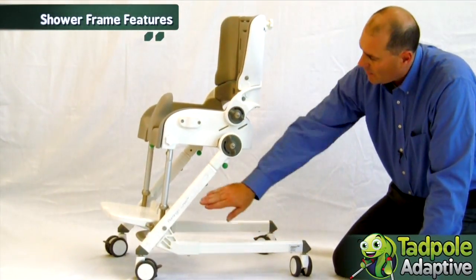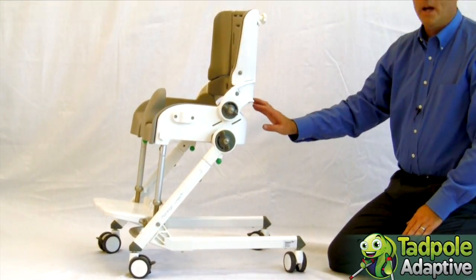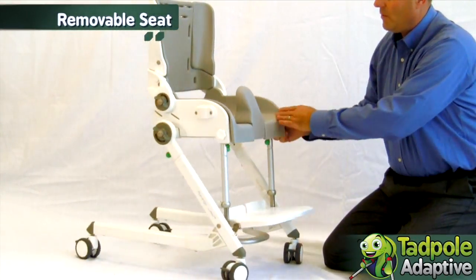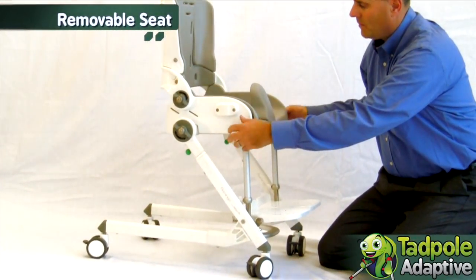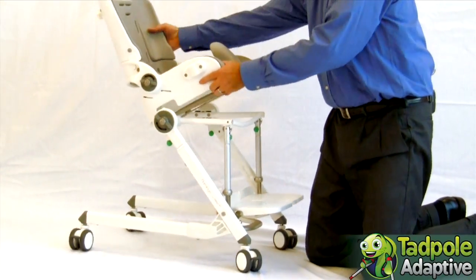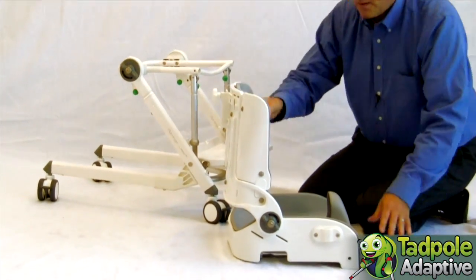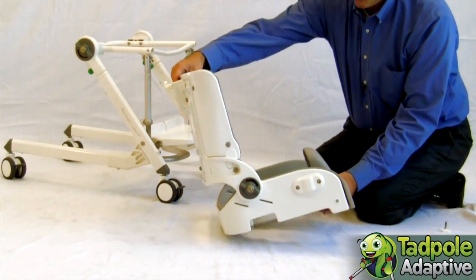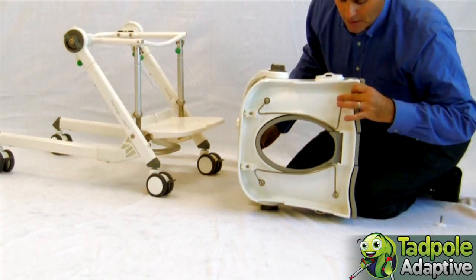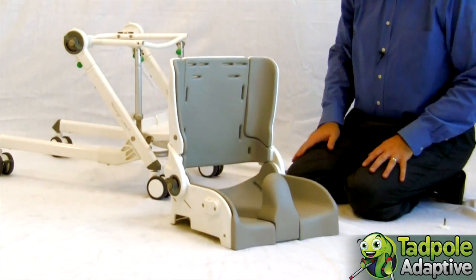The Flamingo rolling shower frame is height adjustable for different commode heights and depths. The seating system is also removable and can be placed on its own independent commode frame to serve as a commode seat, or attach to positions for suction cups to be used sitting on a tub floor.